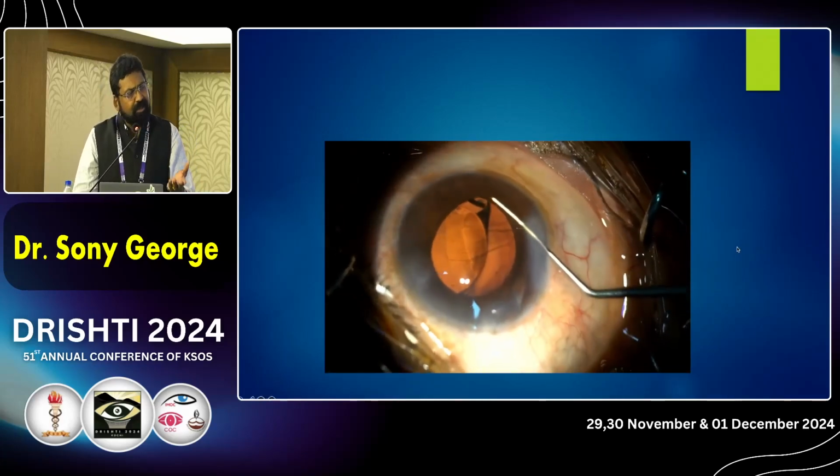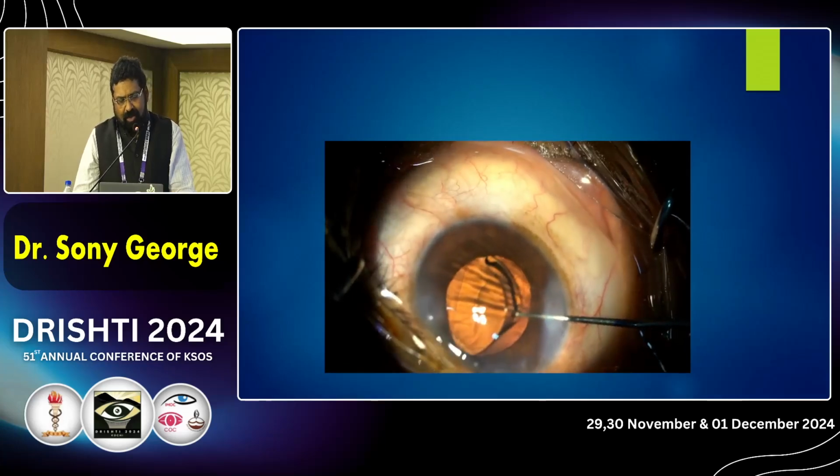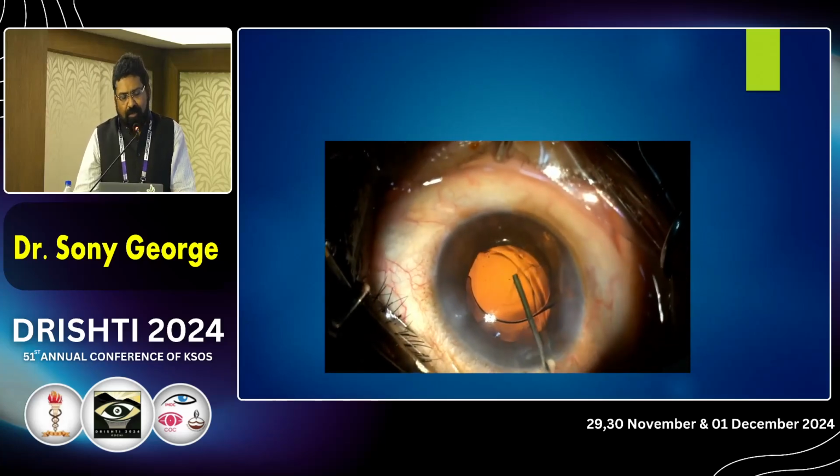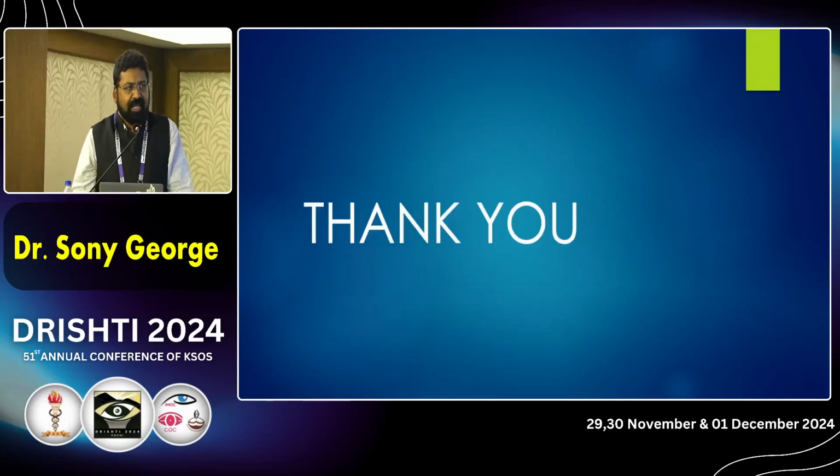Obviously, toric IOLs we need to realign, and the higher order aberrations we need to treat accordingly. We cannot do much about it other than stabilize the ocular surface. Thank you very much.